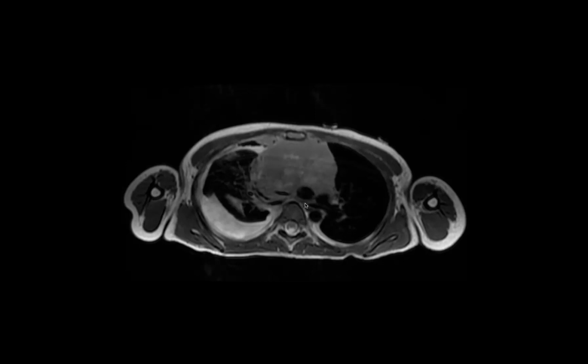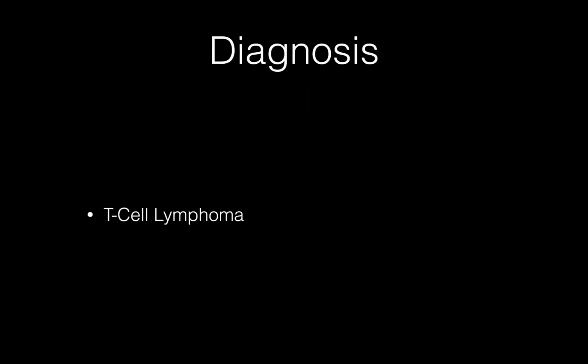One of them is lymphoma. Other ones that tend to happen are what are called teratomas, which have fat in them, right? So you can tell, okay, this one has no fat in it. So off of those two most common ones, we've excluded one. This is most likely lymphoma. But ultimately, these things still need tissue. So these need a tissue diagnosis, and so they would go on to biopsy. So this one was again a lymphoma in this case.